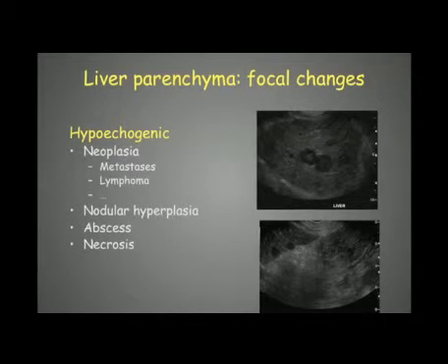The problem with ultrasound here is that it's not very specific to determine the cause of hypoechoic nodules like that. It's very sensitive because we see them very easily, but it's difficult to differentiate with ultrasound alone between a malignant problem and nodular hyperplasia, which is very benign and without consequences for the dog.